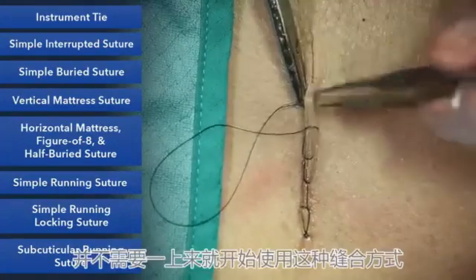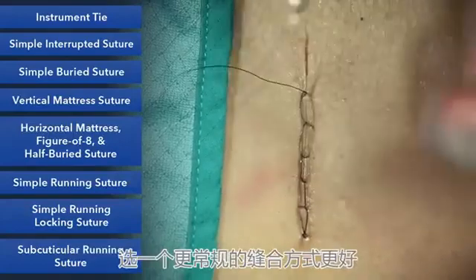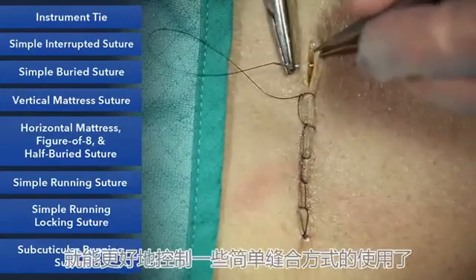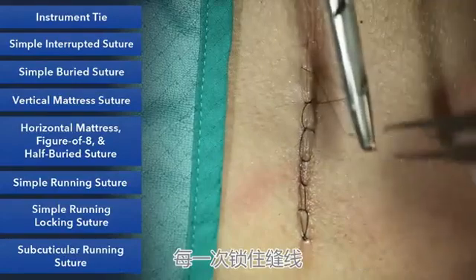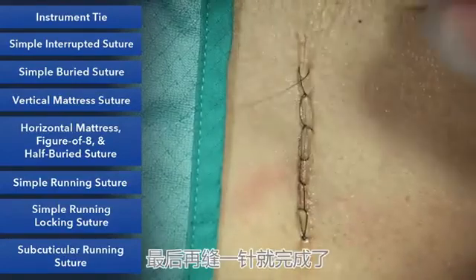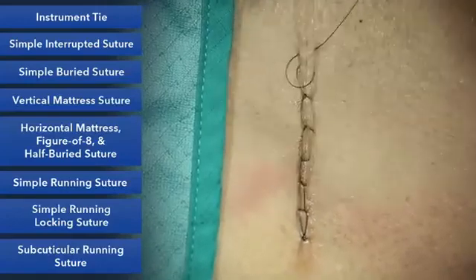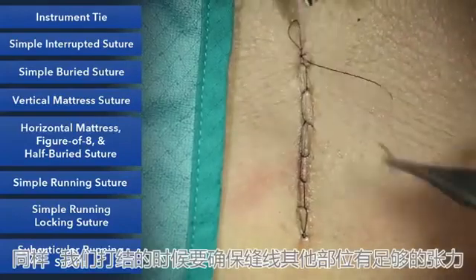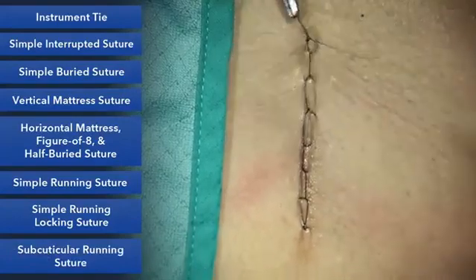So it's not a suture necessarily that you'll use primarily, because I think for scarring purposes you prefer a regular suture. And I will say also, as you become more and more expert at suturing, you'll be able to control your simple suture much better, each time locking the suture. And we're going to end this with a simple stitch. And again, when we tie this, we want to make sure we have good tension on the rest of the suture. And that is our running locking suture.